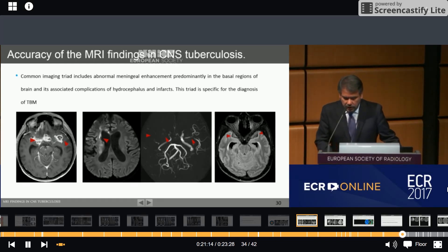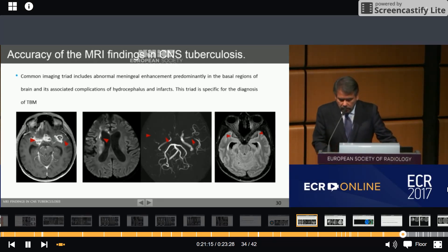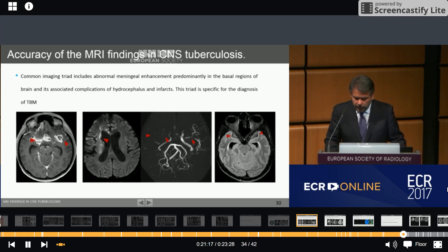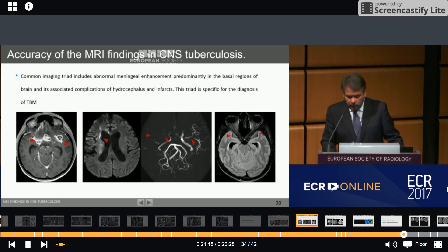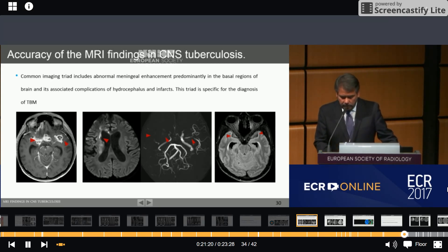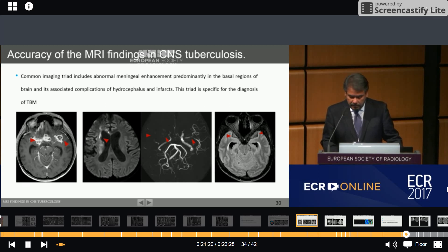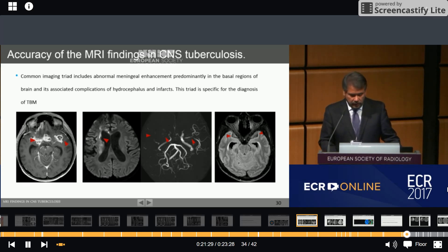A common imaging triad includes abnormal meningeal enhancement predominantly in the basal region of the brain and its associated complications of hydrocephalus and infarct. This triad is specific for the diagnosis of TB meningitis.